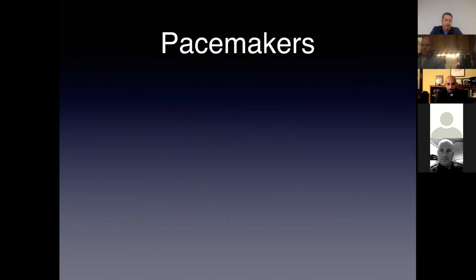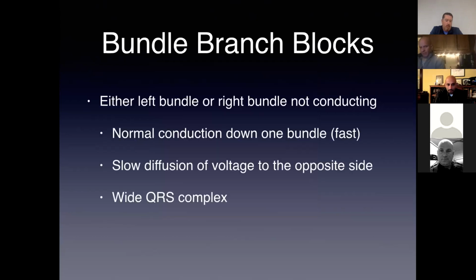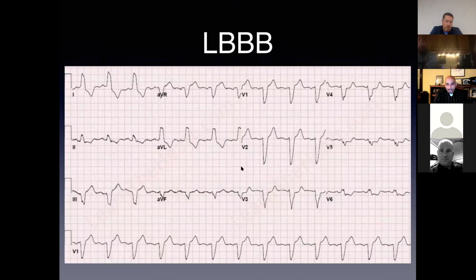So I'm going to go back if I can here. So here in this right bundle that we looked at, QRS goes up, T wave goes down, QRS goes down here. That's actually the bigger part of the down, and this goes up and down. And if we go to the left, down and up, up and down.